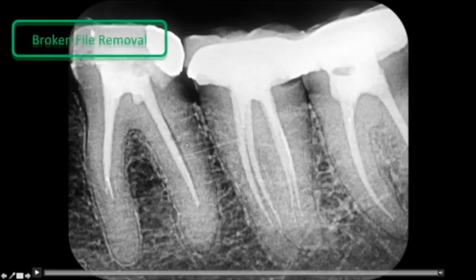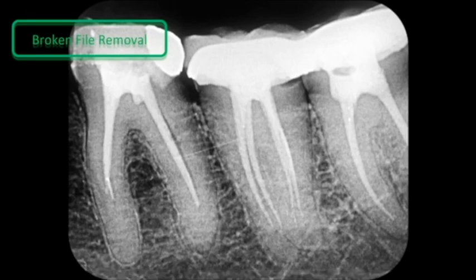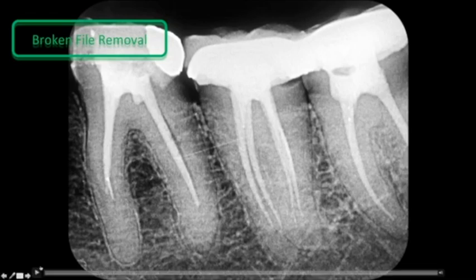So here, again, the first lower molar. The visibility in the lower molars is the most difficult to get because the positioning of the mirror and the microscope are very, very tricky, and the learning curve is very long.